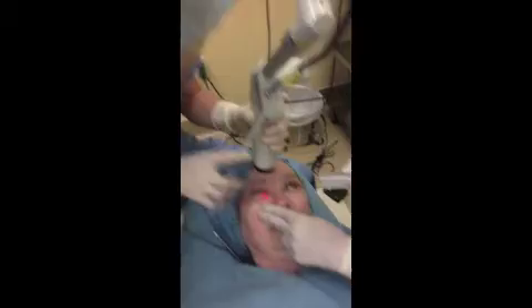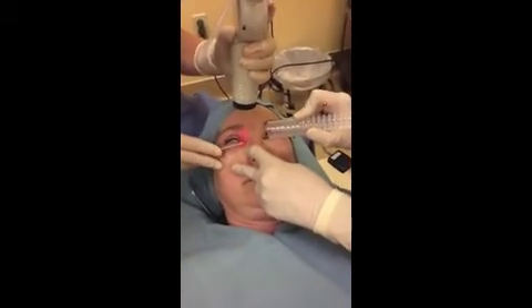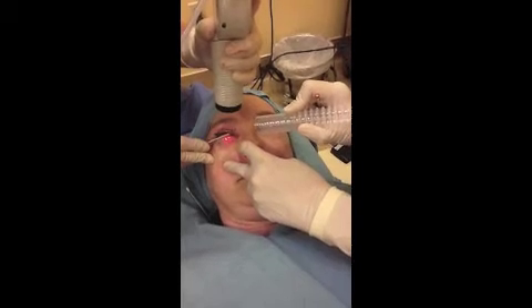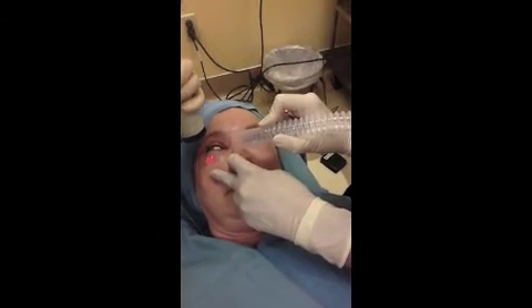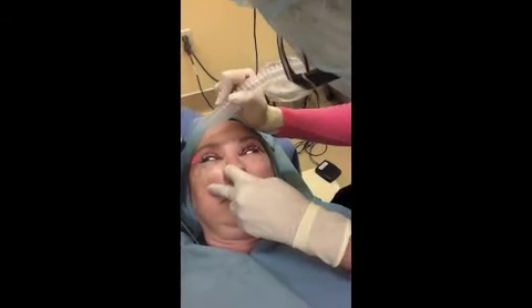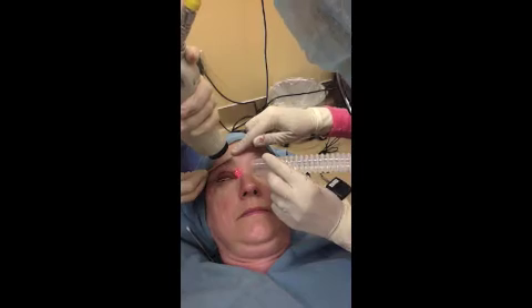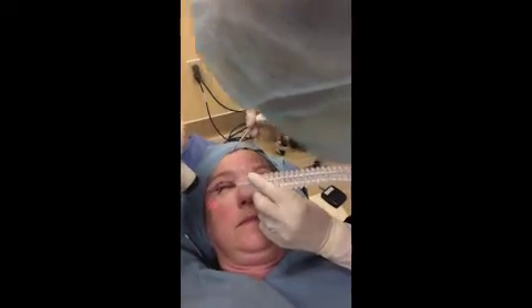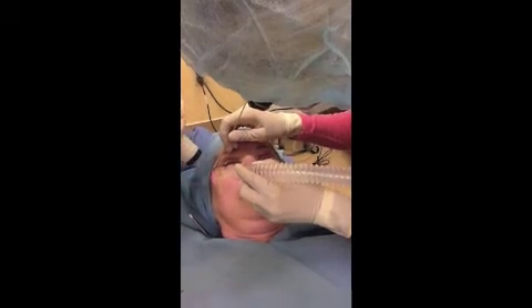Look up at the back wall. Is somebody going to edit this? Yeah. So there we go. You're doing great. I'm going to try again so you can see. We're going to try again. My head's in the way — can you see? Yeah, now I can. A little spicy out there. Hang tight, hang tight, hang tight. I'm done. And then I'll look over it. I've got to change my size a little quicker.